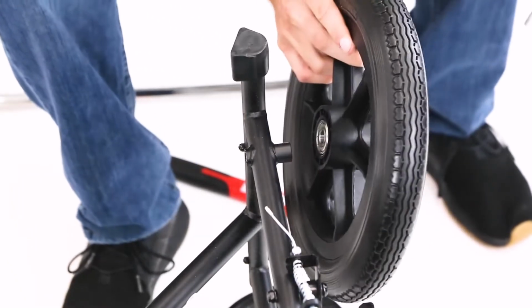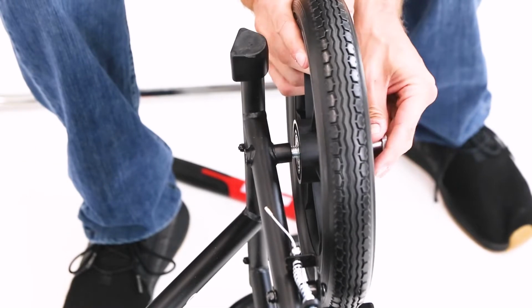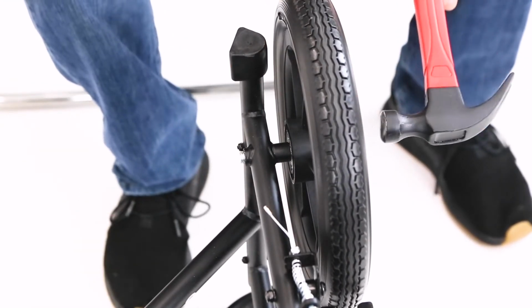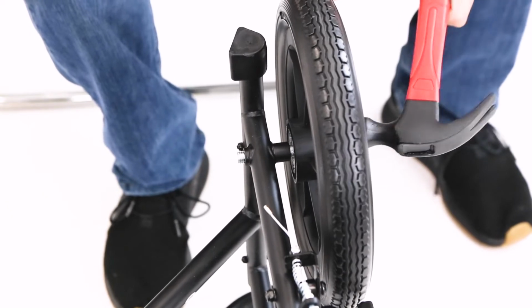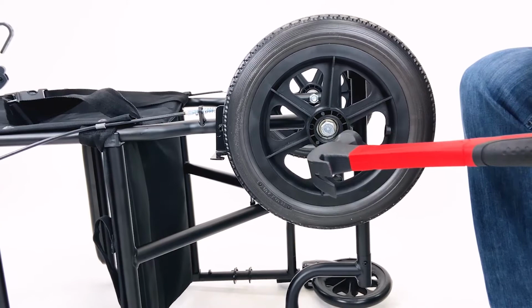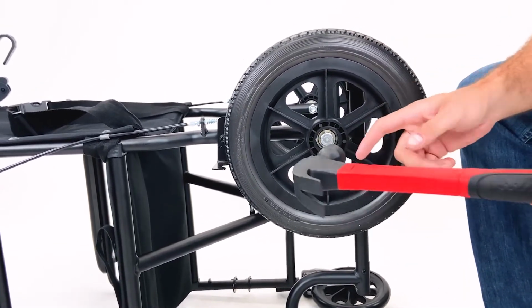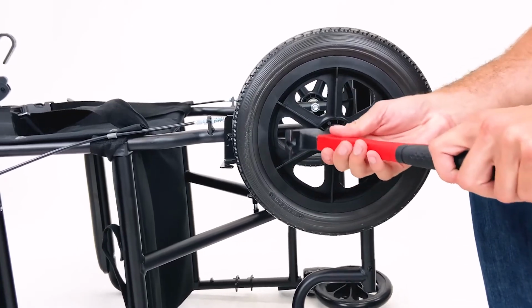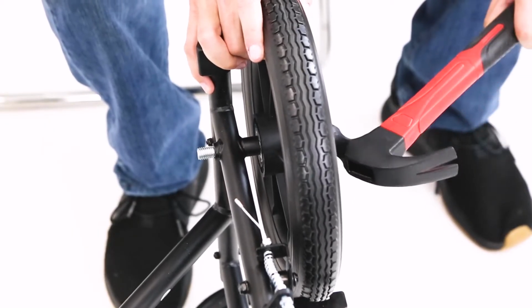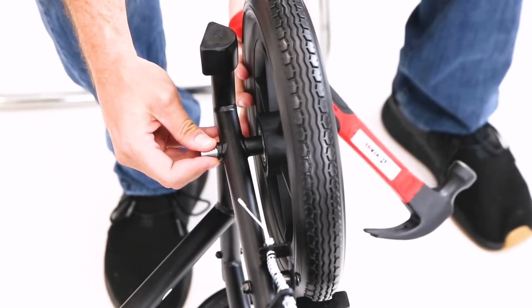Then you'll just place the new wheel on the same way. Next, you'll want to take a hammer and push the bolt back through again so you can get it in there nice and tight. You'll probably want to take this edge and just force it in, because you want to make sure the wheel and the bolt are nice and tight and through, so there is no wobbling.